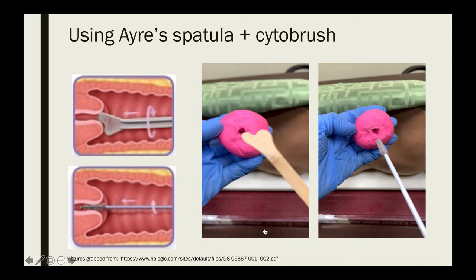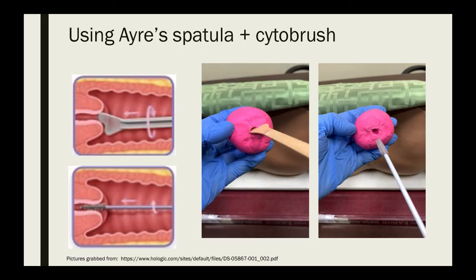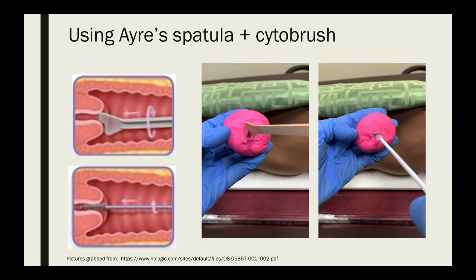Here again is the Ayer spatula with cytobrush technique demonstrated using a clay sample. Using the Ayer spatula, place the protruding end over the endocervical canal and rotate the contoured end around the ectocervix, then smear the sample over one area of the glass slide. Using the cytobrush, insert it into the endocervical canal, rotate gently, and smear the sample over one area of the same glass slide.